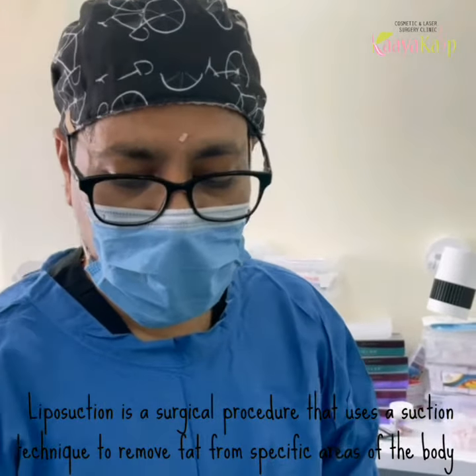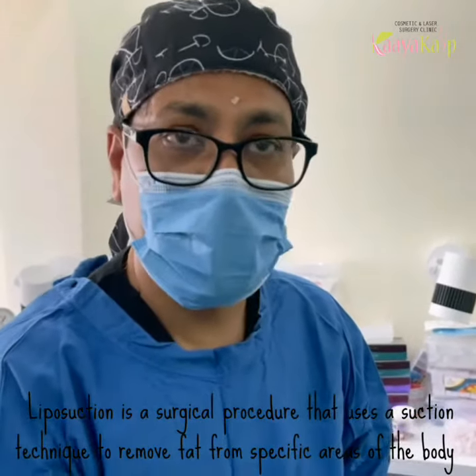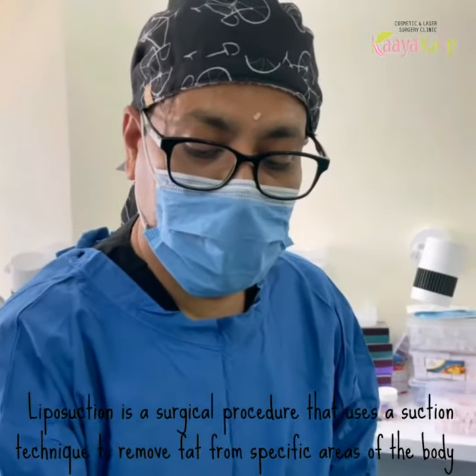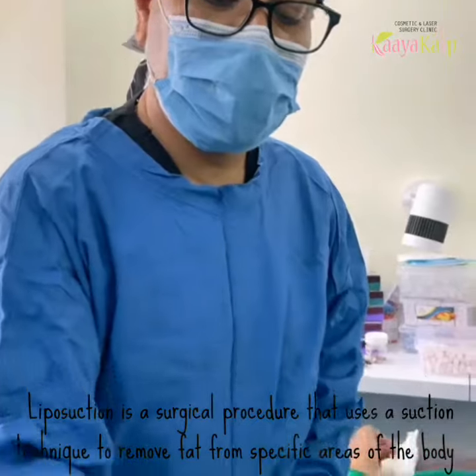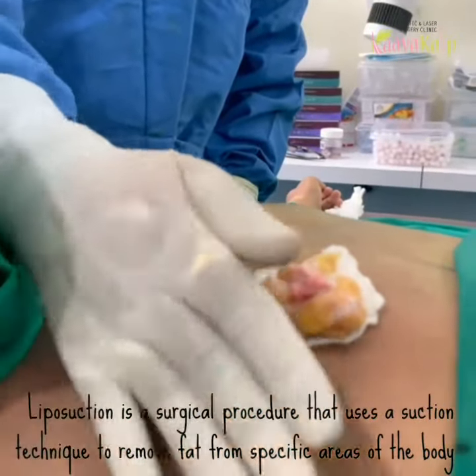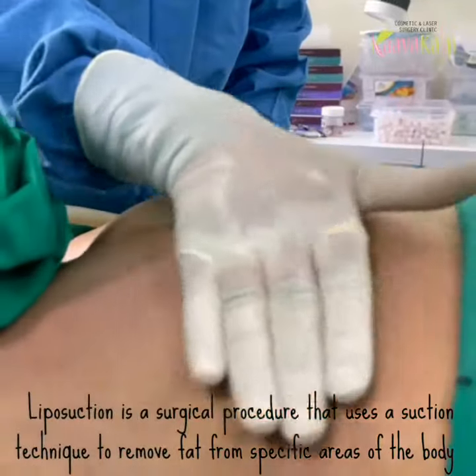So till now what I have done: I have done a liposuction on the left-hand side, and the gland has been excised. You can see the gland on the right side — this is entirely smooth.